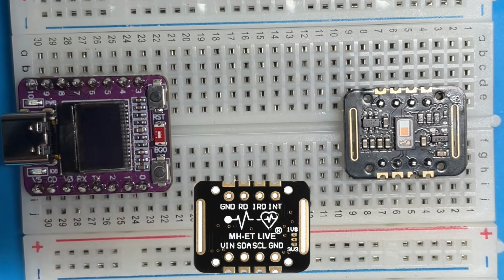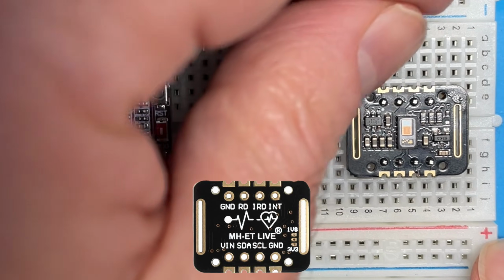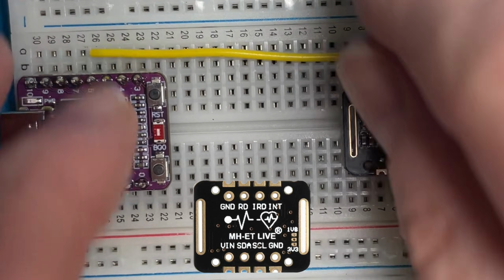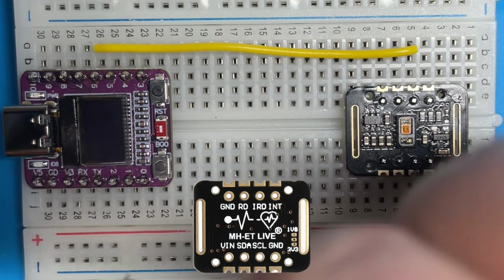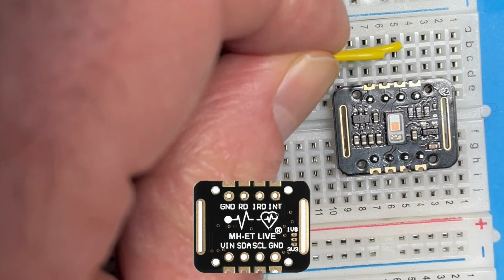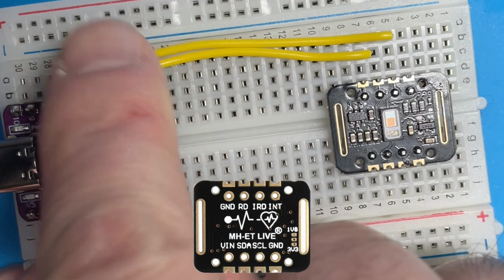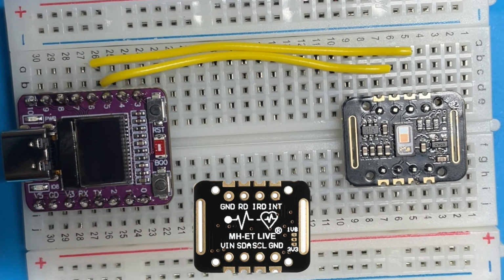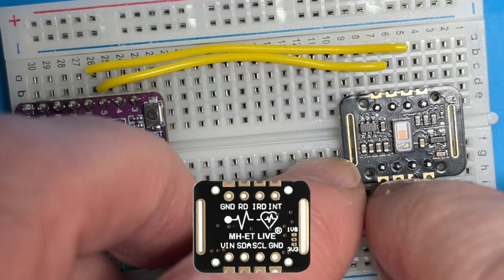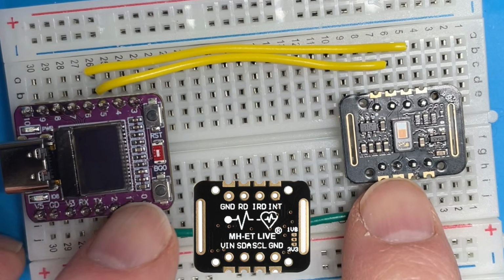So the wiring up is pretty simple. We're going to connect pin 6 to SCL, which should be this one here. Pin 5 will do SDA, so just connect pin 5 over to SDA, which is this one. So that's our I2C connections wired up. This top pin here is the interrupt pin, so that tells us when we've got data. I'll connect that to pin 2, I think.